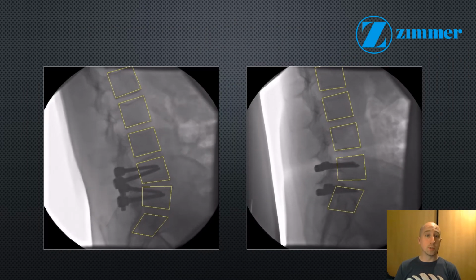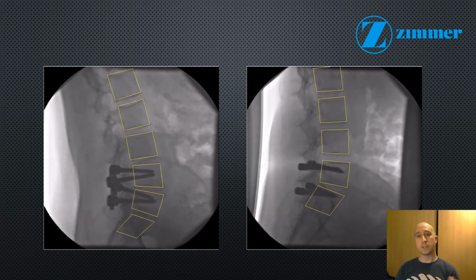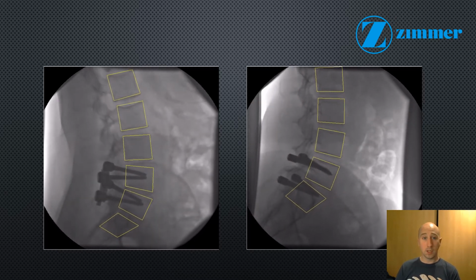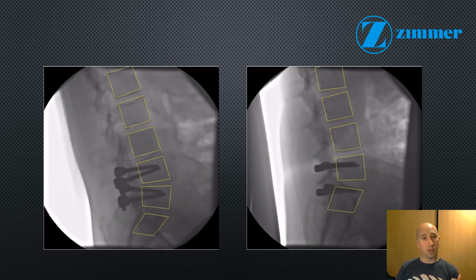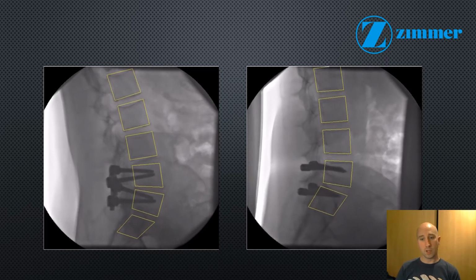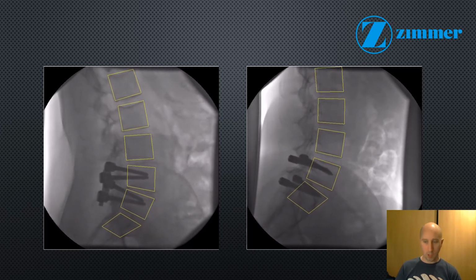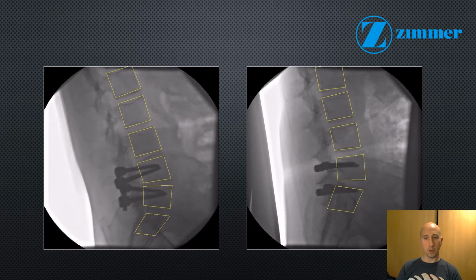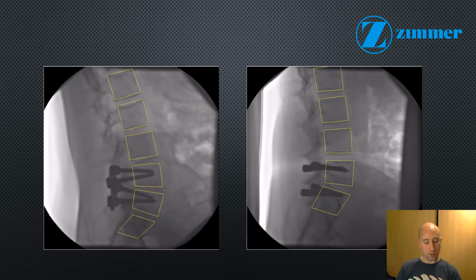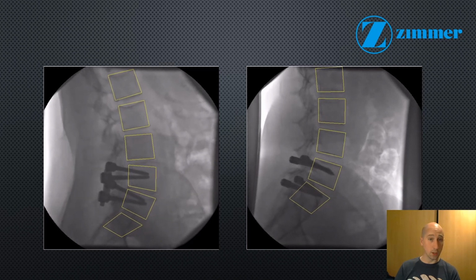One of the most engaging pursuits of the clinical technological collaborations is the challenge of assessing multi-segmental dynamics from imaging. We've worked with some medical device companies in the past to assess the functionality of spinal implants. Here you can see flexible fusions versus rigid fusions, and we're measuring the mechanics of the spine post-fusion, but we could also look pre-fusion as well and follow that person over time. There are other surgical interventions that we've been approached to investigate, including scoliosis and scoliosis surgery.